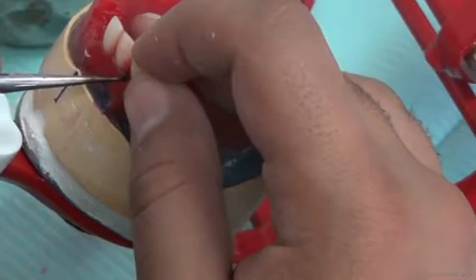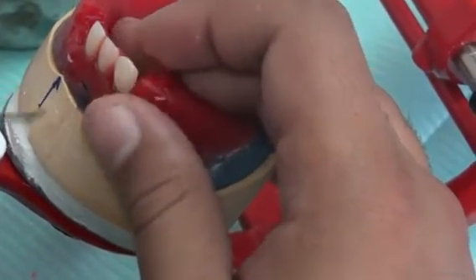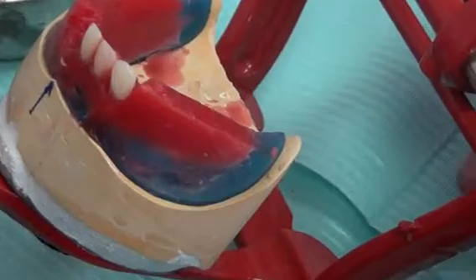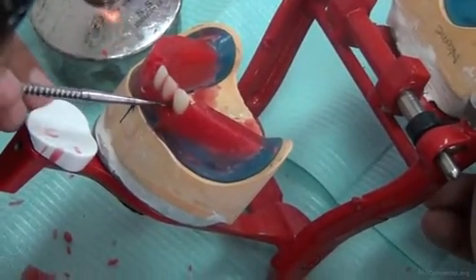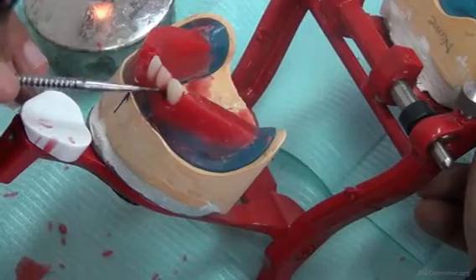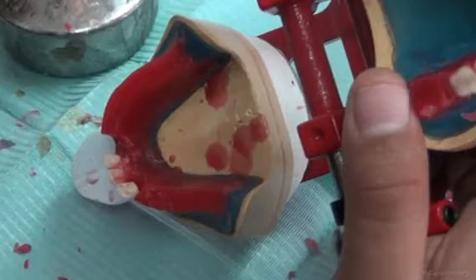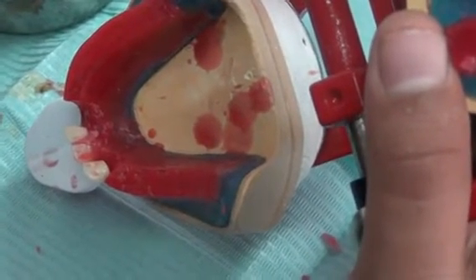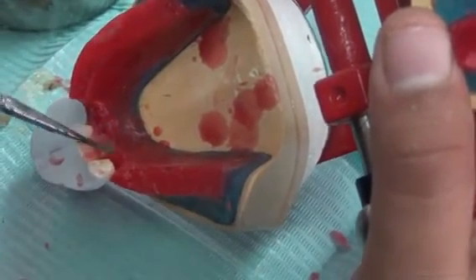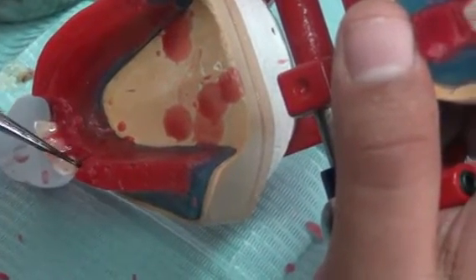And which arch would we follow? We're going to follow the upper arch. So after adding and correcting the position of the canine, I'm going to finalize its position, comparing it with the upper. So I melt from the buccal side and from the lingual side. I make sure that the tooth is first secure. And at the same time, this melting will soften the wax beneath it, so I can move the tooth easily into location and correct its angulations.